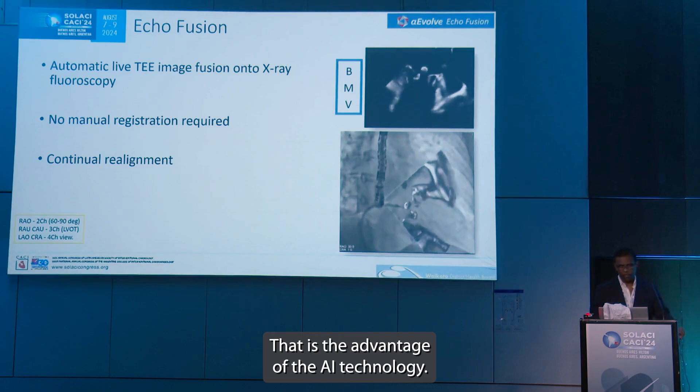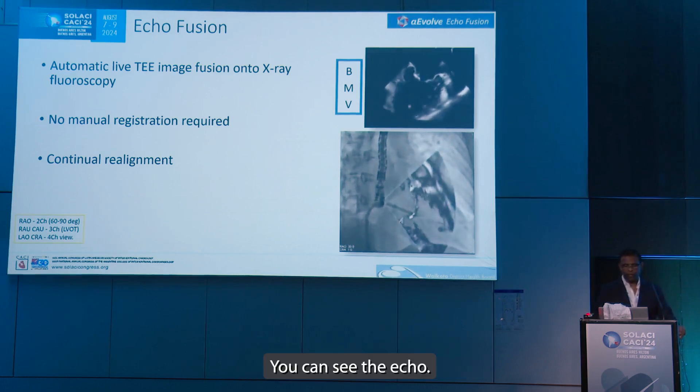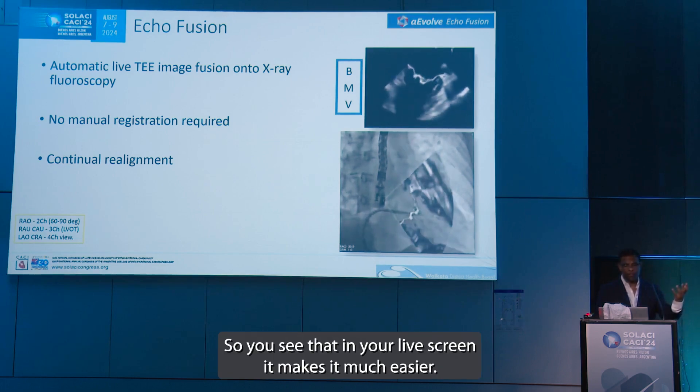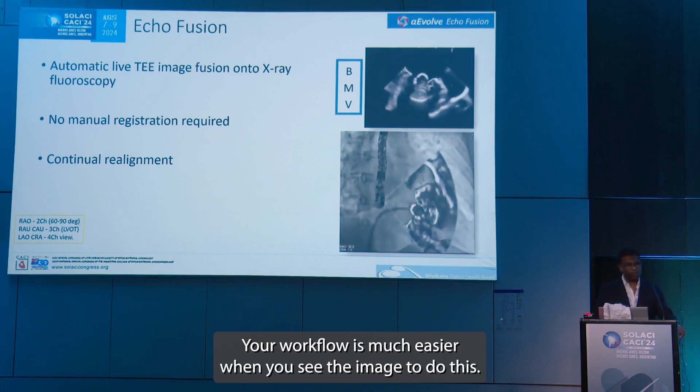Here is a balloon mitral valvuloplasty — you can see the echo now. You see the soft tissue has come onto the fluoroscopy image, so you see that in your live screen. It makes your workflow much easier when you can see the image to do this procedure.